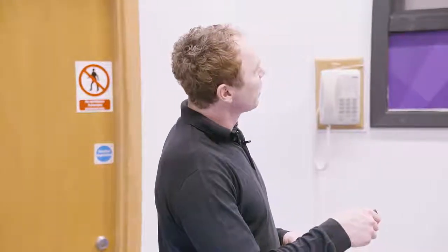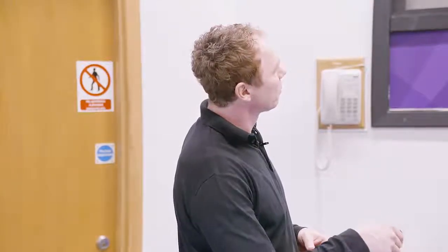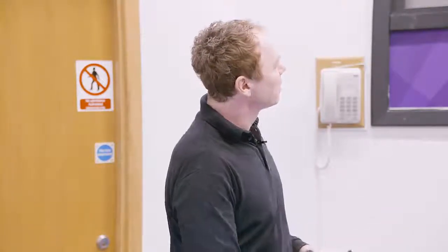You have the same thing for displacement, or muscle tonus. This green area would be the area of the optimum tonus. If you're on the inside, the muscle is too stiff. If you're on the outside, the muscle is too loose. Again, you would like to see everything within. So both erector spinae muscles here are a little bit loose, the left biceps femoris is a little bit stiff, the left gastrocnemius medialis is a little bit stiff, and all the others are somewhere around the average values.